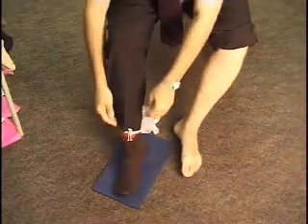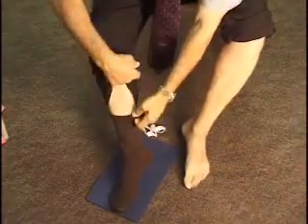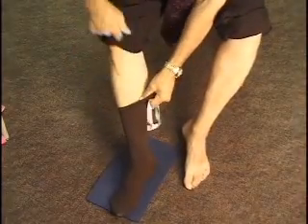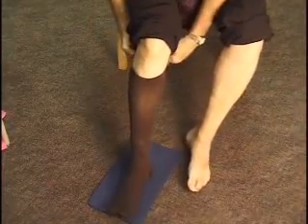Then the hose can be lifted up very easily and the applier can gently be separated from the snaps as seen here and pulled out underneath the stocking. Reassembling the snaps, the applier can then be used multiple times.